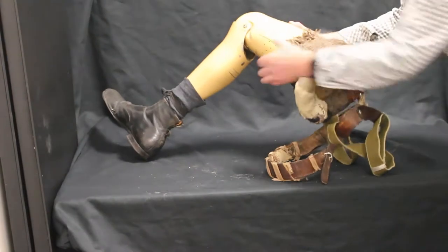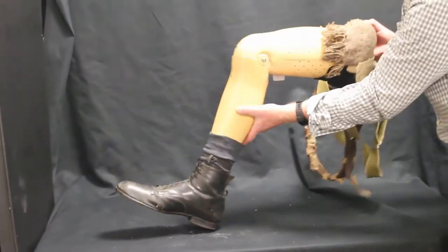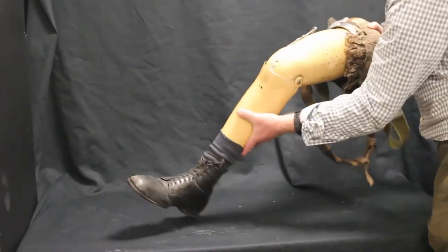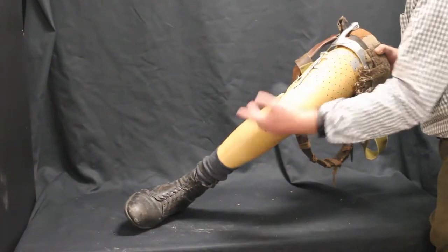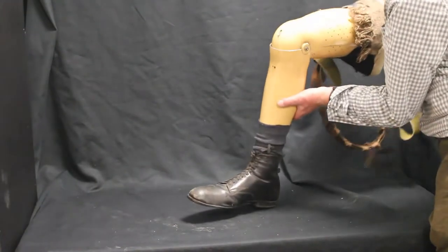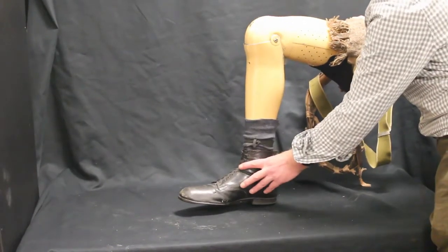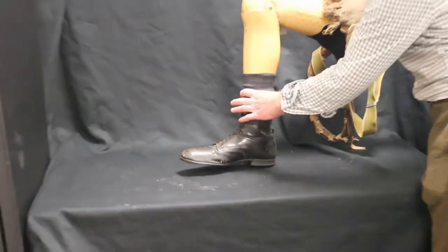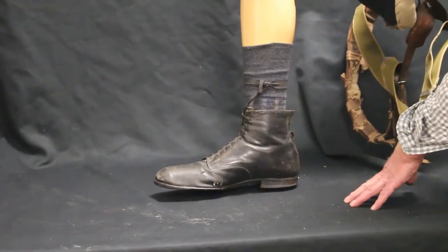Here we have a full right leg prosthesis hinged at the knee with a common lever to lock or unlock the articulation of the joint. The foot has a boot, laces, and a sock all to give some form of normality about the limb because it has a good cosmetic appearance.